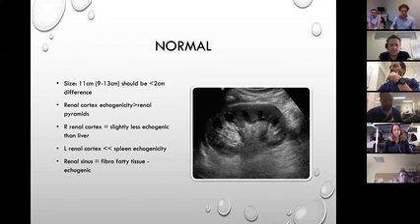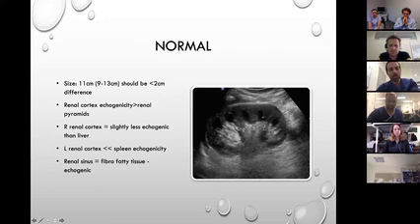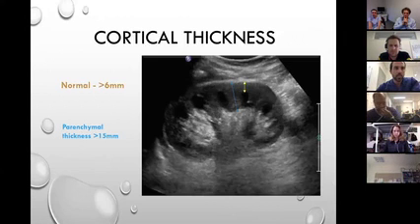So there are other causes for liver reflectivity, like cirrhotic livers, or if you've got masses, and they are reflective too. All right, but anyway, fatty liver is a very common thing to look into. So the left renal cortex and the spleen echogenicity, that's another comparison between kidney and spleen, and kidney and liver, from one side and the other. That's how it should look. Renal sinuses, I told you about, they are fibrofatty tissues, so they should look nice and bright, echogenic inside. All right, good. Move on to cortical thickness.